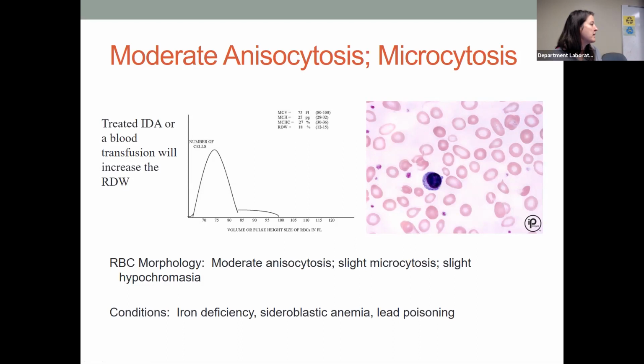So this would be another example after treatment of iron deficiency anemia where that bone marrow is starting to pump out those polychromatic erythrocytes. And then maybe sometimes even after a transfusion, which looks different than our bimodal peak that we saw. That would be like a very severe case. And it's all about timing of when that sample was collected too.